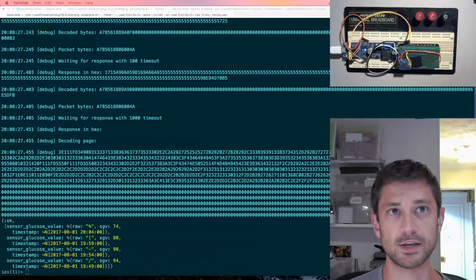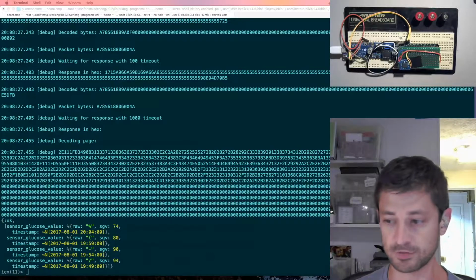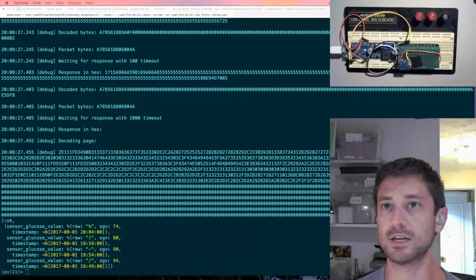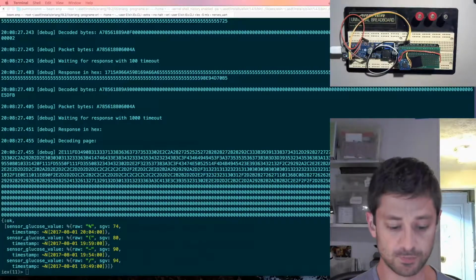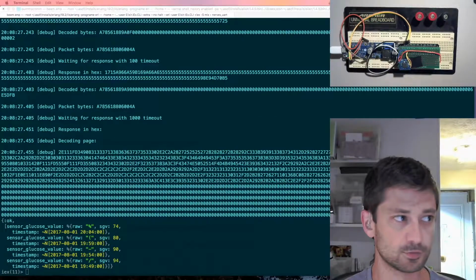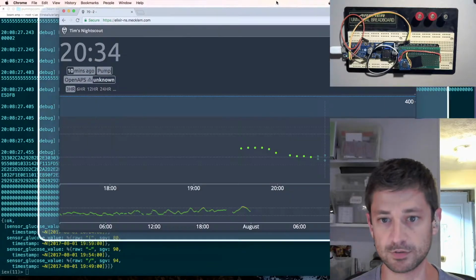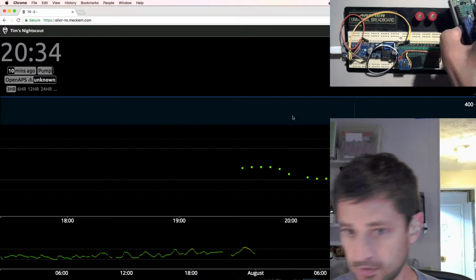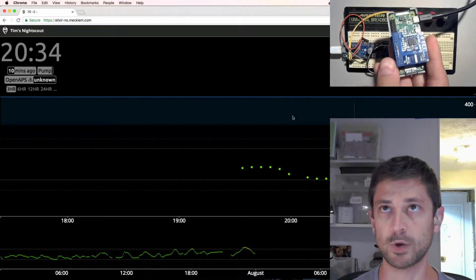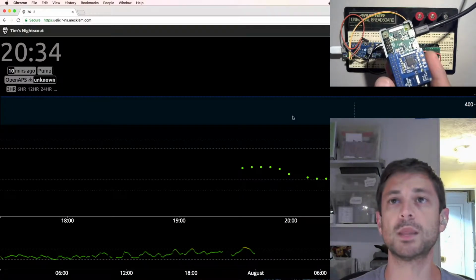The thing that I'm working on right now is I have this firmware that runs, so it's an entire operating system with the Nerves firmware, and it has the pump communication happening. So every 5 minutes, I get continuous glucose information, and it gets pushed up to Night Scout. I'm actually wearing the continuous glucose monitor myself right now, and so this is what it looks like when it runs. You can see I'm kind of holding it up here. This is a Raspberry Pi Zero with wireless on it, and also has a special chip on top that talks to a Medtronic insulin pump.